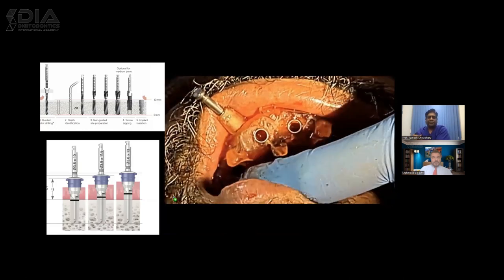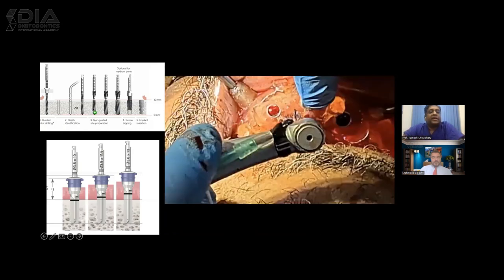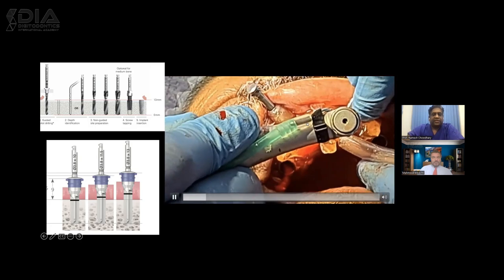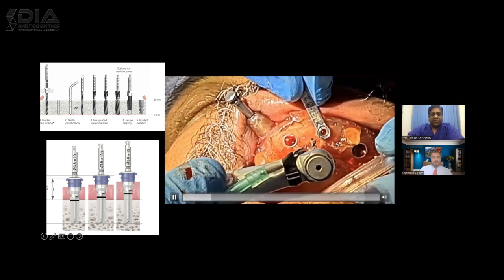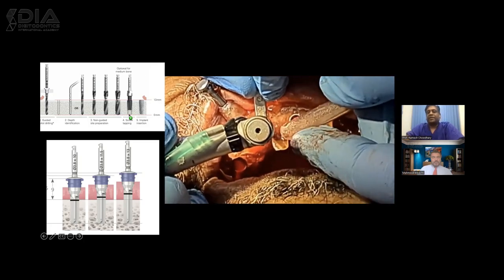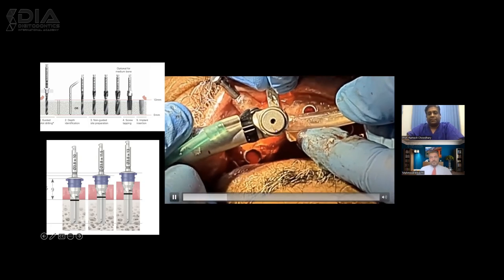And if I have to tell you, various companies come with various kinds of things. If you see Nobel Biocare, it comes with drills of longer lengths, but they don't have an offset incorporated in them. So you need to use the sleeves to get to the dimension of the final drill. You can see here that the sleeves have been used from 2 mm thickness, then gradually increased to various thicknesses, and that is how you can go to the final drill. So the sleeve is of the final dimension. That is how it is for Nobel Biocare.